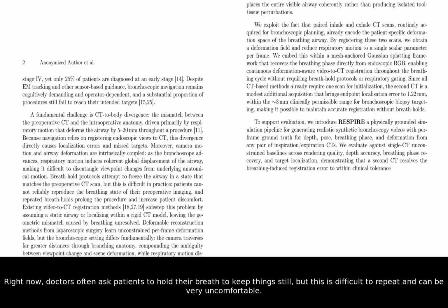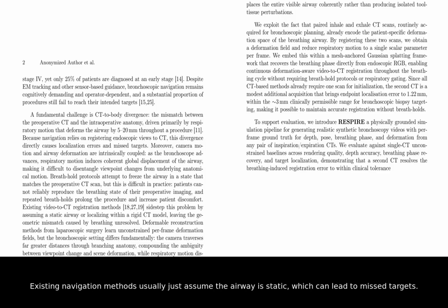Right now, doctors often ask patients to hold their breath to keep things still, but this is difficult to repeat and can be very uncomfortable. Existing navigation methods usually just assume the airway is static, which can lead to missed targets.